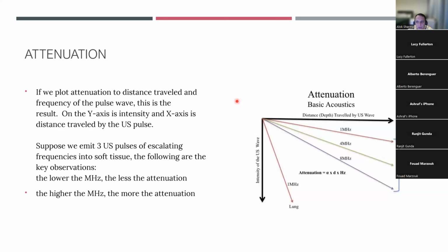But if I then want to concentrate on the pleura, and I'm using a GE machine where the focus is at every level, I might just increase my frequency to see the pleura much better, giving me a crisper image of the most superficial structures in that baby. I might even increase gain.